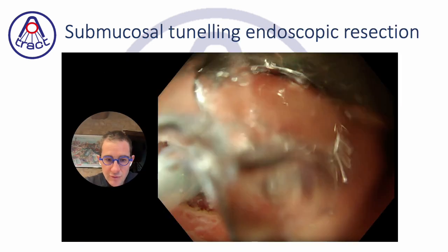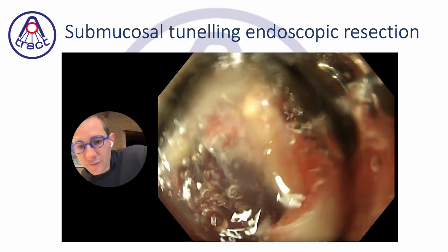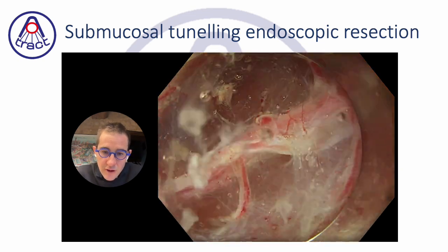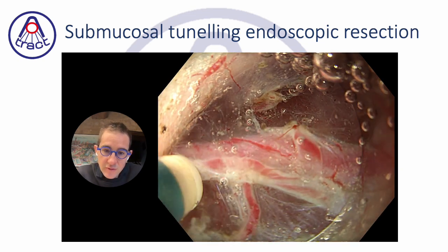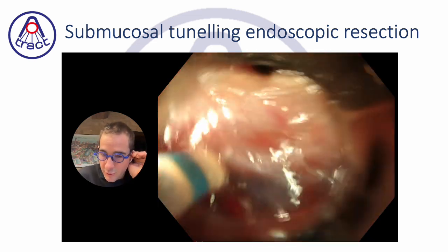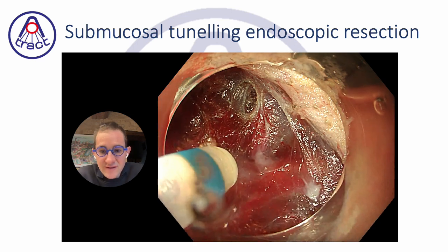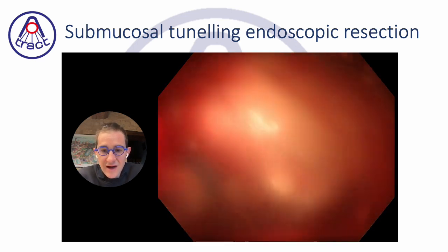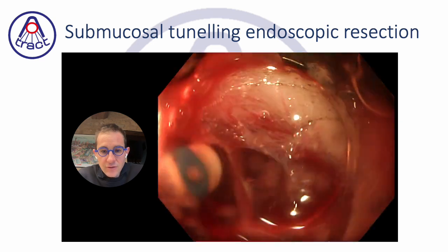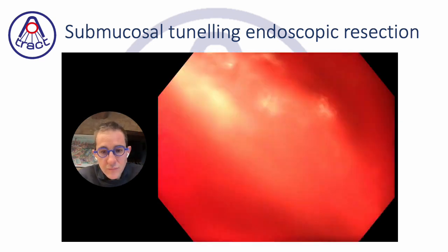So I will present you here the complete case of the resection by STER. The movie was not working at the beginning, so unfortunately we missed the initial incision, despite the fact that it is an important point, because we should really precisely target the axis of the channel. I will show you in a few minutes that I go outside the channel very frequently.